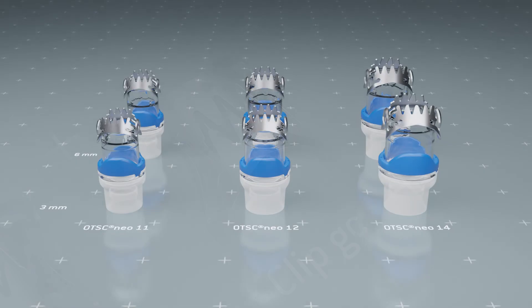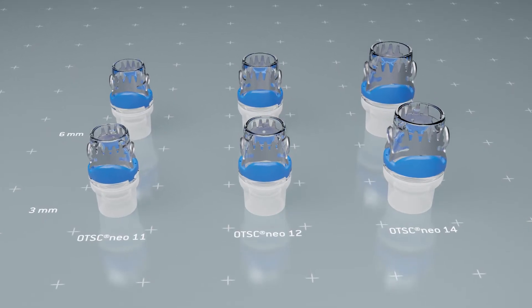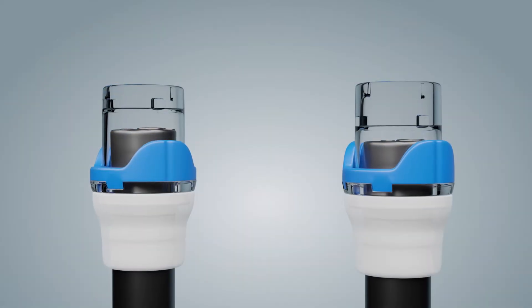The clips are mounted on matching application caps. The caps are available in system sizes 11, 12, and 14. All three sizes are available with a cap depth of three or six millimeters.